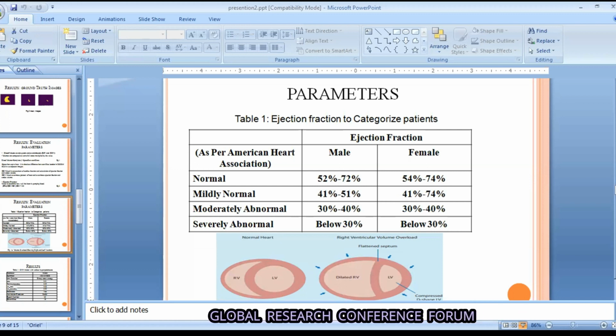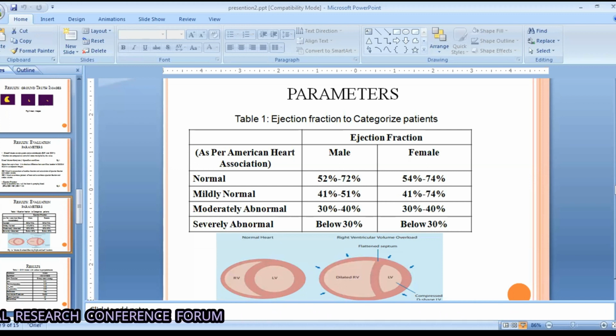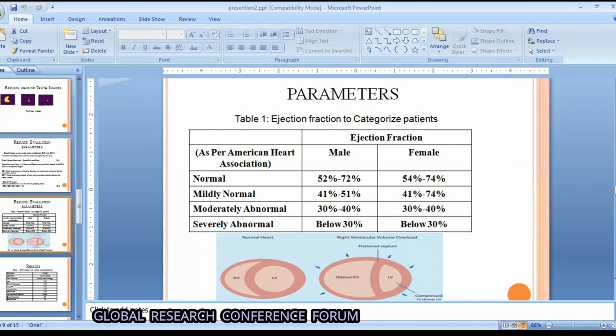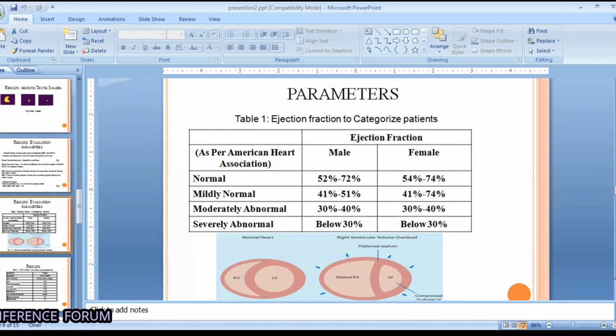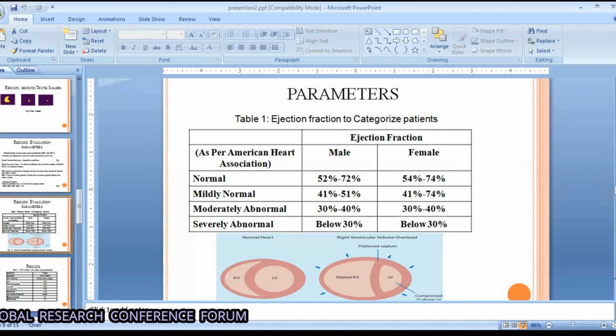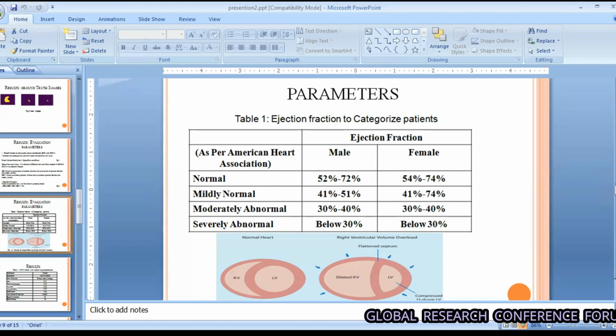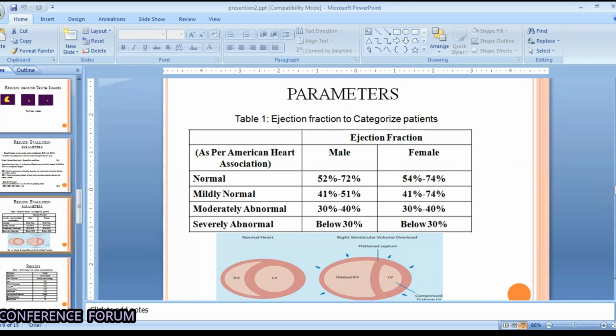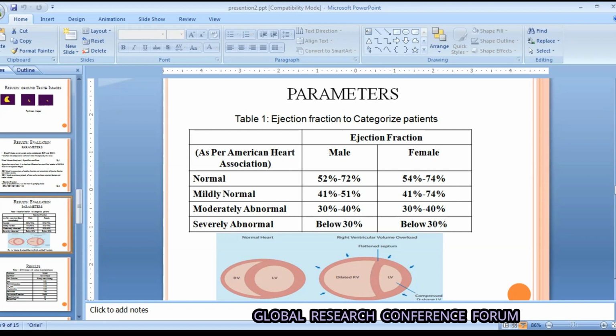For SGD, the blue color line shows the validation loss and the orange color line shows the training loss. And here also the same. We can say the ADAM optimizer is working properly, or gives a good performance response, because the training and validation loss are converging. That's why for further processing, we have selected ADAM as the optimizer. Now the results of training with both optimizers are shown here: the right ventricle contouring is quite distorted with SGD as compared to the ADAM optimizer.